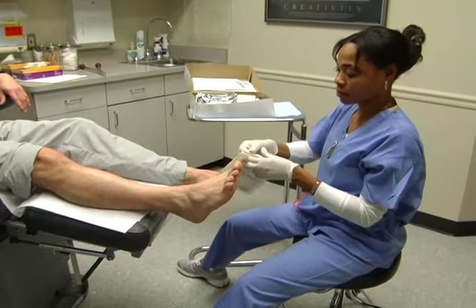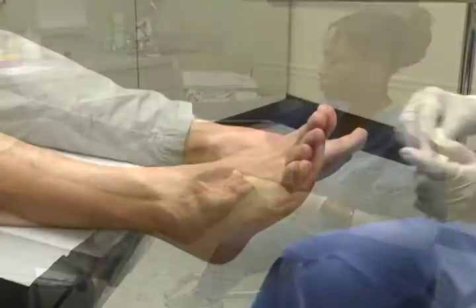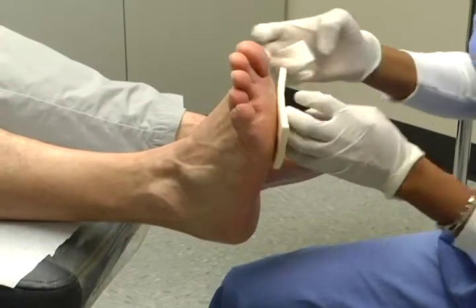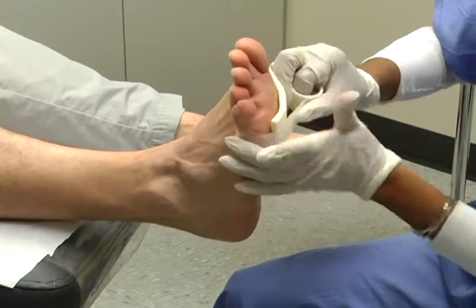Step 1. MedE-Foam Dressing. Do not use the dressing if the sterile packaging appears compromised. Begin by applying the foam dressing to the wound. Use the paper tape to secure the foam to the foot.